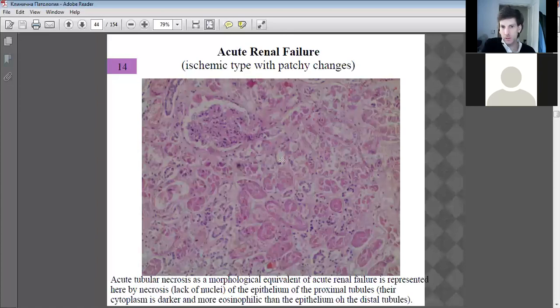What worries me here is this area. There's a lot of thinning of the wall, massive space. It shouldn't be this big, and loss of these cells with the nuclei. So the wall is really thin there. You can see how thin it is there. Thinned, really thinned. There's a normal nucleus there, but here there's a loss of that. And another dark patch of necrosis forming there. So this is pathology.